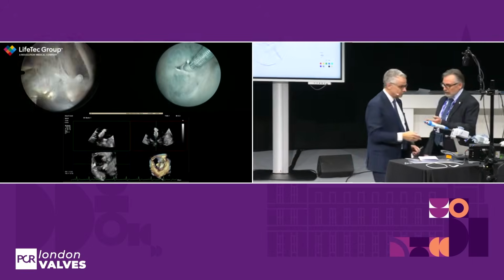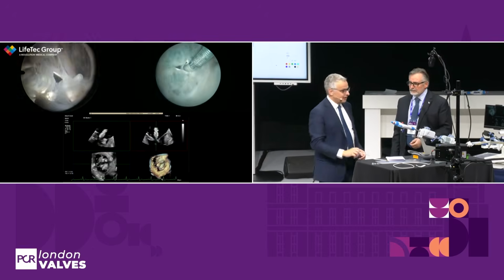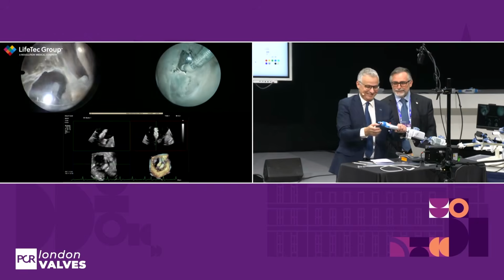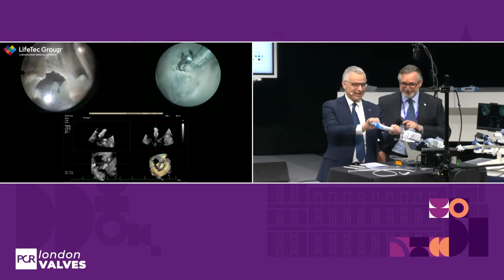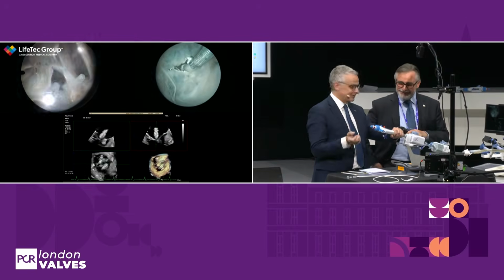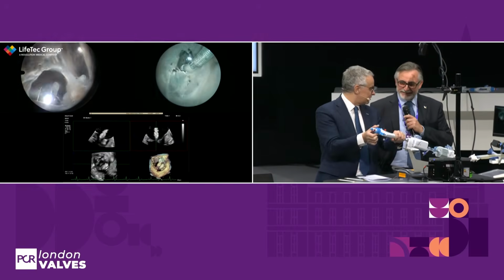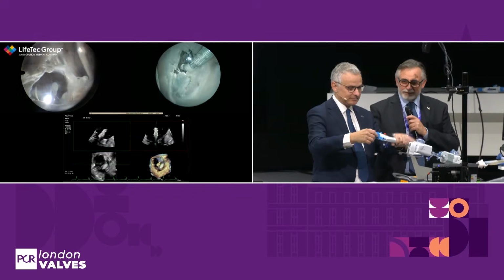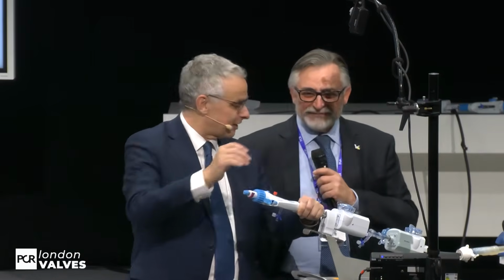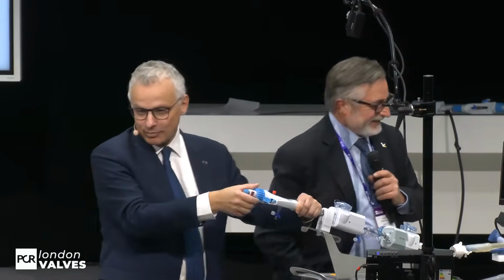Can we go? Shall I do it? Yes, why not? If I fail, I will come and let you. Okay, so what we do, we unlock the system, correct? Sure. Then we close and we open. Raise the grippers first. There is no difference. I can raise afterwards. Raise the grippers. They're already raised. You're fooling me. See, this is the problem with them.